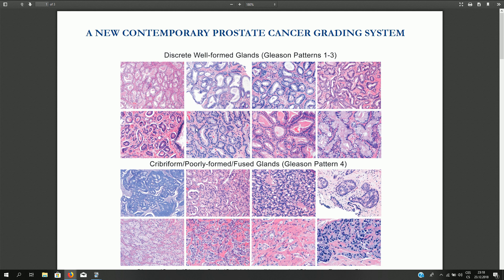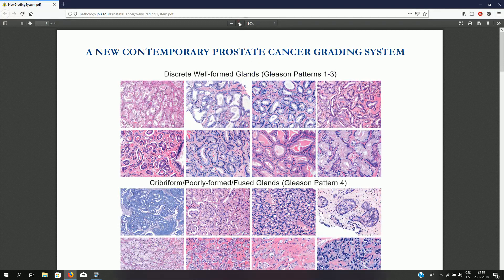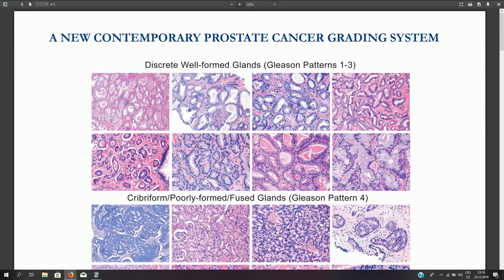How do we diagnose these Gleason patterns? Well-differentiated carcinoma (Gleason pattern 3) is composed of well-circumscribed small acini that are back-to-back with well-formed glands. We can circumscribe each gland individually; there is no fusion of glands and no solid pattern. Typical crystalloids can be seen, and some glands may look quite irregular on the cut surface, but this is not true gland fusion.